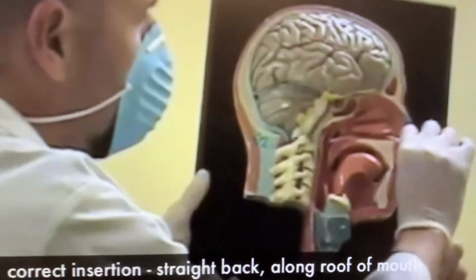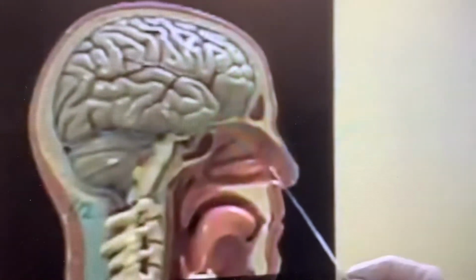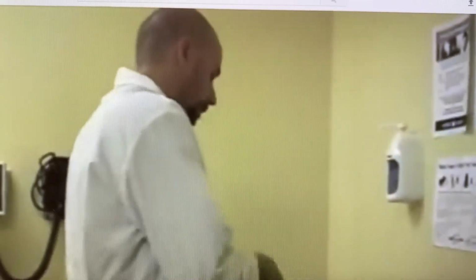Remember, the swab must be inserted straight back, parallel with the roof of the mouth. Do not insert the swab upwards. When finished, remove your mask and gloves and wash your hands thoroughly.